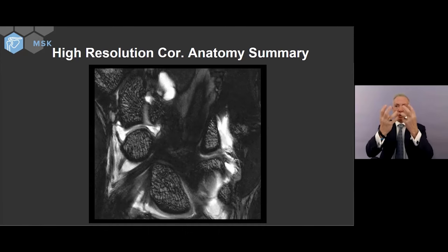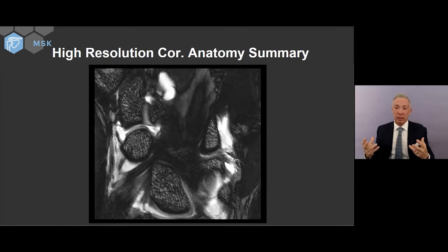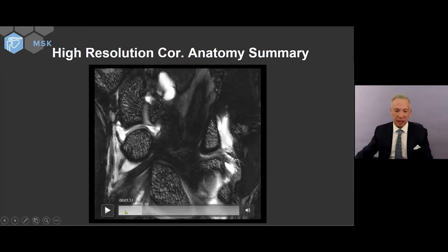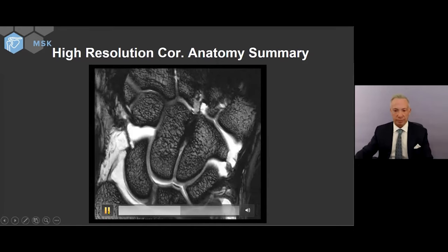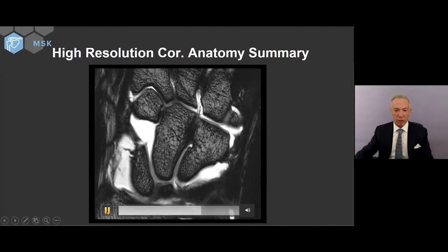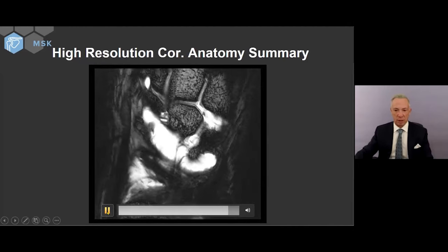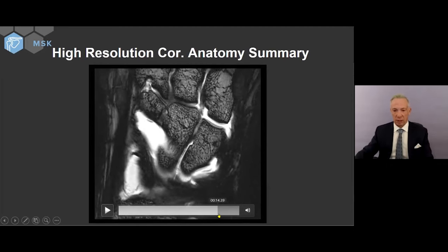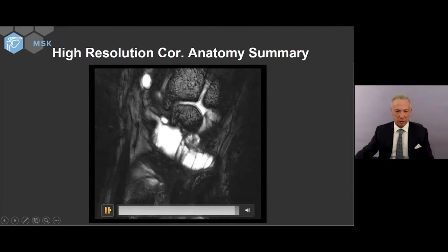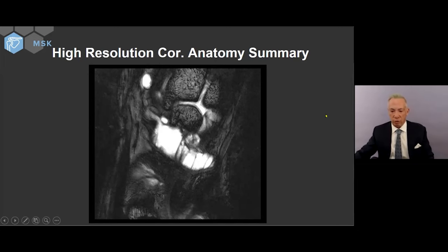Now let's look at the dorsal aspect of the wrist — I'm just going to show you one ligament. This is the dorsal intercarpal ligament. There are some other ligaments proximal to it, but this is one that gets injured when you fall on an outstretched hand. Let's look at the intrinsics. The intrinsics include the scapholunate ligament, and here's my mnemonic: LTV — the lunato-triquetral ligament — is stronger on the volar side; SLD — the scapholunate ligament — is stronger on the dorsal side. The dorsal portion of the SL ligament is more band-like. The middle is triangular and sometimes will have a little cleft. The SL ligament is kind of trapezoidal in shape.